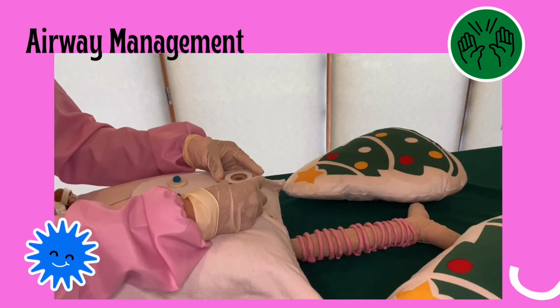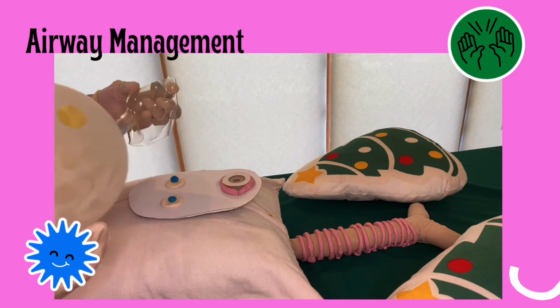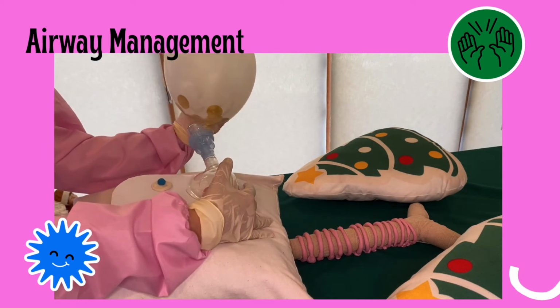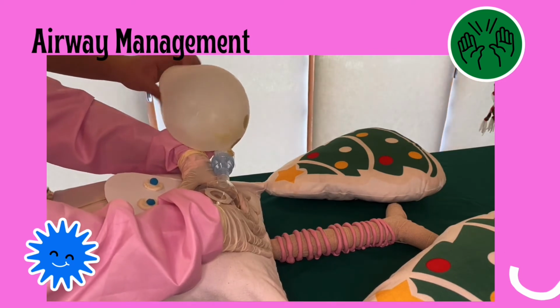For mask ventilation, the jaw thrust maneuver provides a tight seal. The thumb and index fingers should make a letter C shape with a downward pressure, while the other fingers form a letter E on the jaw and the fifth digit at the mandibular angle. The patient is obese, so a two-handed technique is preferred.